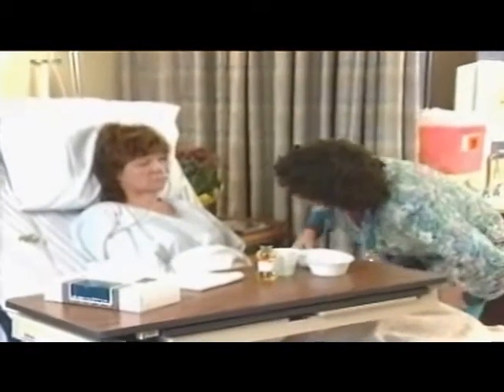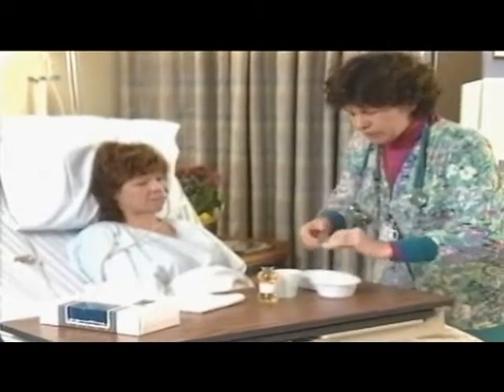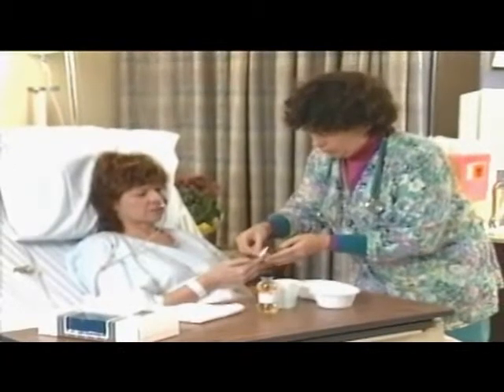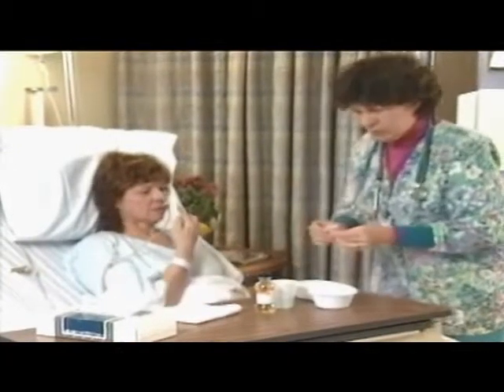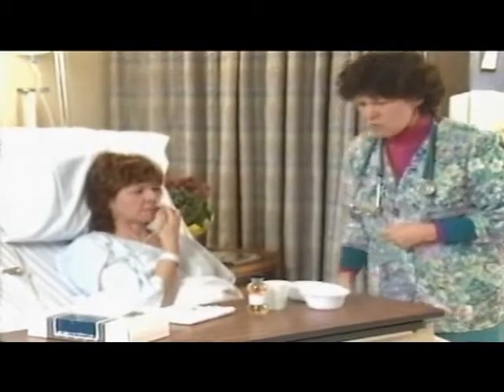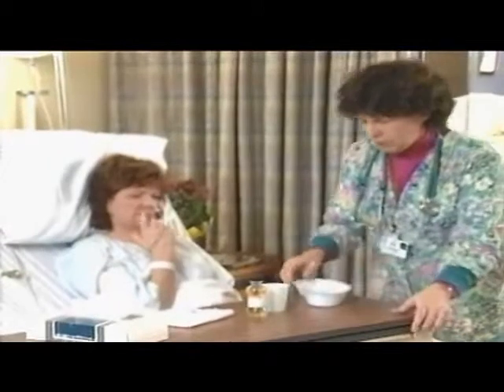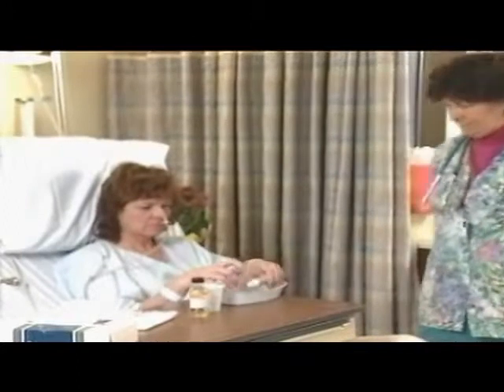The nurse provides frequent oral and nasal care. Ensure that the tube is not rubbing or eroding the side of the nostril. Provide water-soluble lubricant to prevent drying. Maintain patient comfort and frequently check with the patient to make sure the tube is secure and allows freedom of movement.